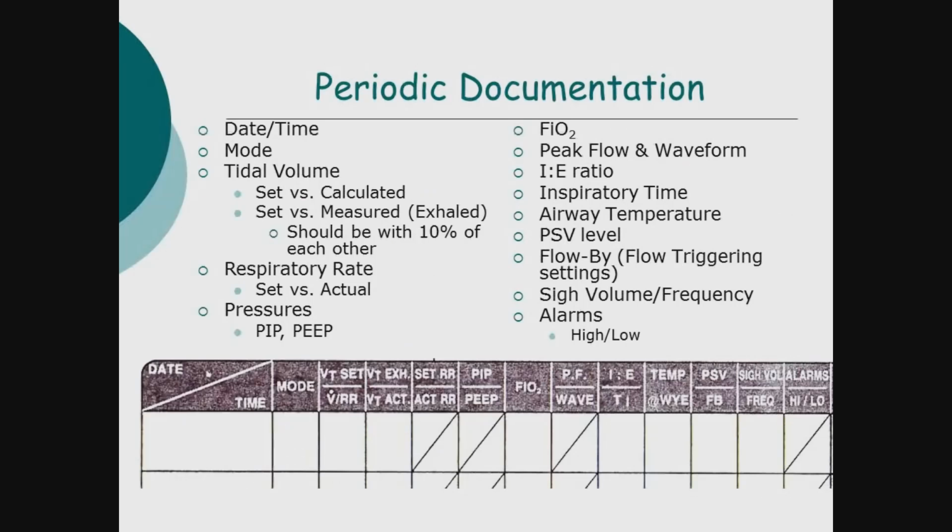When we document, it's more than just writing down or documenting numbers. It's looking to see how that interrelates with the patient. And I'm just going to skip through these because we don't really physically do a documentation per se. In fact, the way more and more the electronic medical records are set up is that you just push a button and it dumps all the data directly from the ventilator into the EMR. I don't know if yours is set up that way yet. But that's the sweetness of it, it'll automatically extract all the data so it's into the medical record.